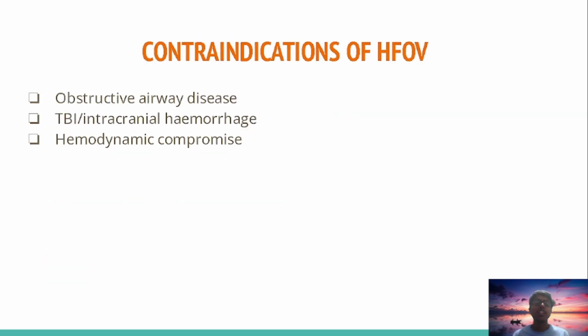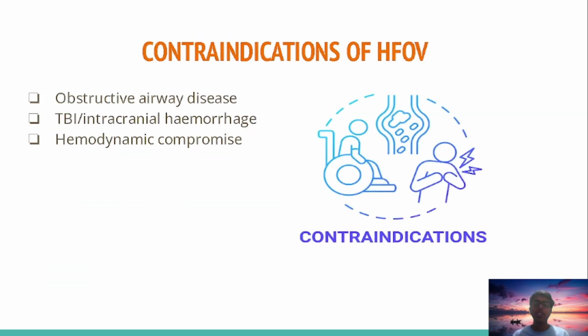The contraindications are obstructive airway disease, traumatic brain injury or intracranial hemorrhage, and hemodynamic compromise. These are the contraindications, and there are no absolute contraindications for HFOV. These are some of them I have given you.